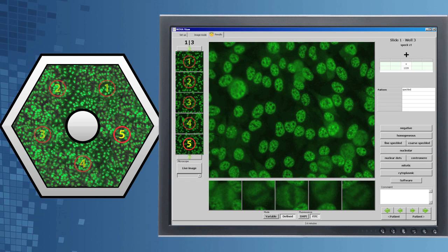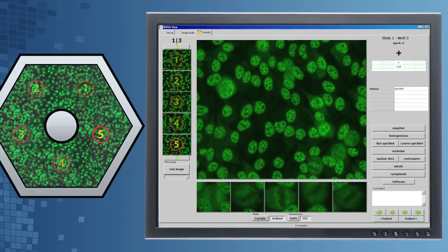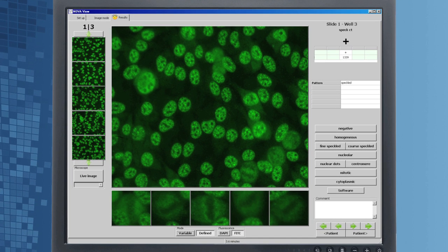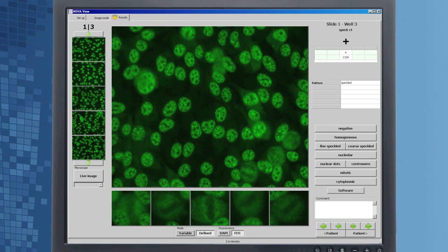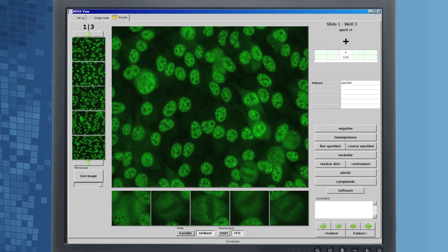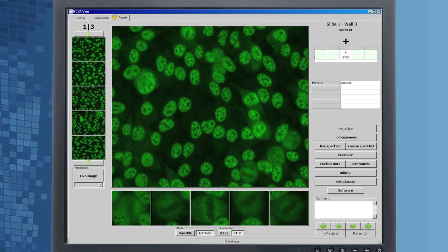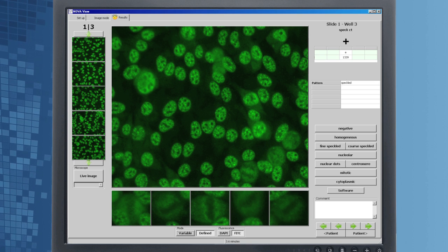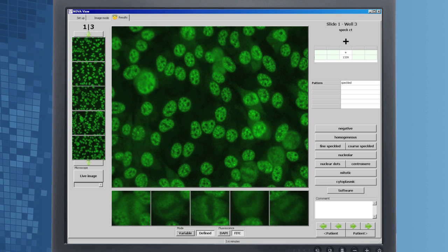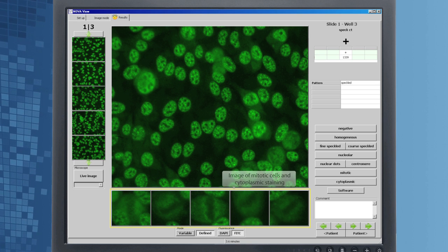The entire process takes an average of one minute per well. The confirmation screen summarizes information captured from each well, allowing you to review, edit, and confirm results while viewing multiple fields at once.